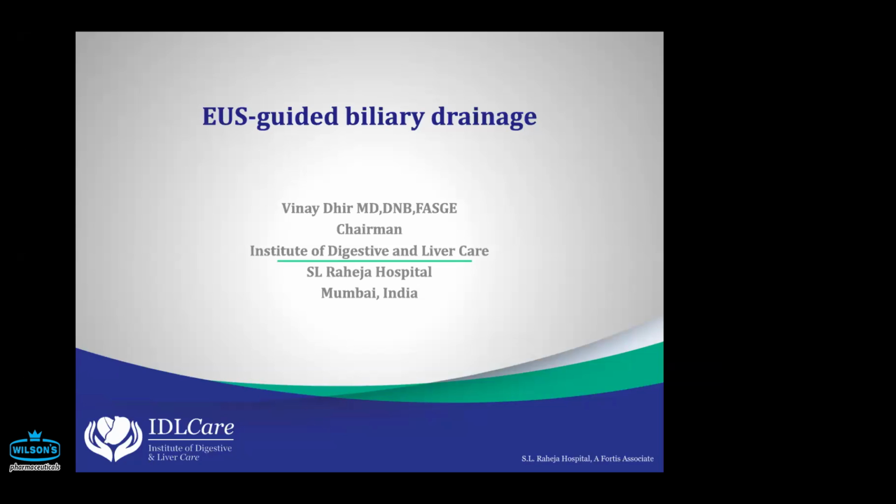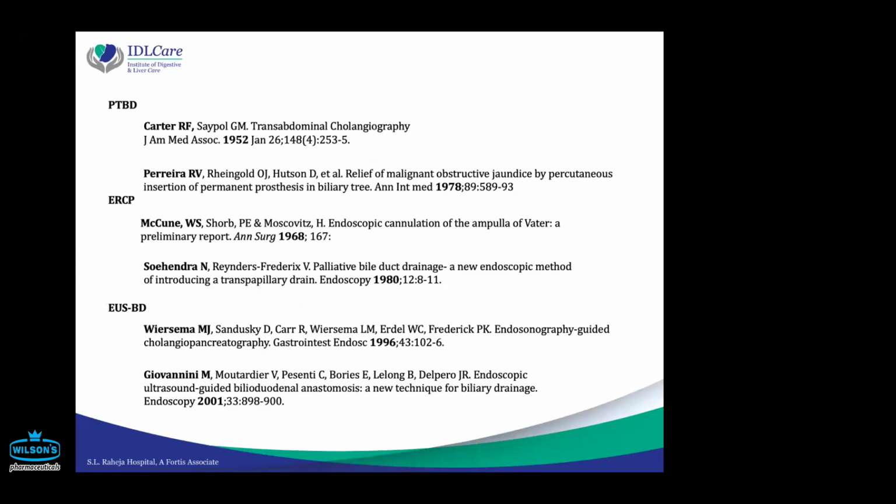The topic that has been given to me is very close to my heart: EUS guided biliary drainage. It's a wonderful technique. Of course, when I talk about it, probably I will sound a bit biased. That is natural because I'm attached to it for more than a decade now. But let's go back a few decades, before EUS-BD, or EUS guided biliary drainage, started.